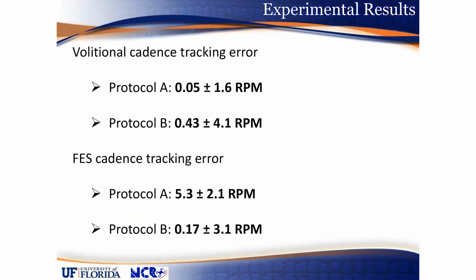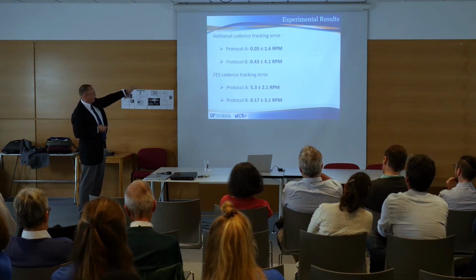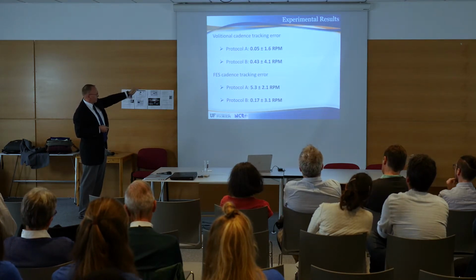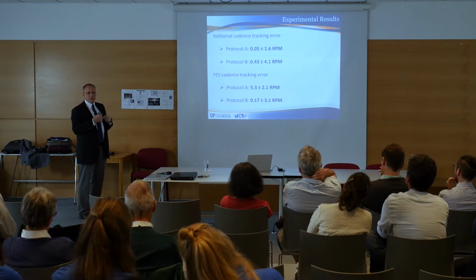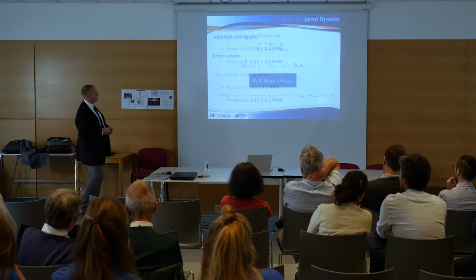So we compared volitional cadence error with cadence with FES. In the healthy normal individuals, they were able to pedal 50 RPMs plus or minus basically 2 RPMs of error. And when we told them, okay, now do not pedal, and we're just going to apply FES, the error is like 7 RPMs of error. The person with Parkinson's disease voluntarily has about 5 RPMs of error, but then when we added FES on top of their ability, we were able to reduce the error by a little bit. So that was kind of nice to see.